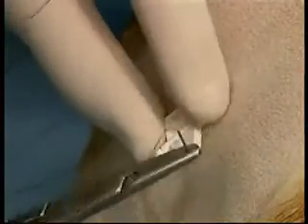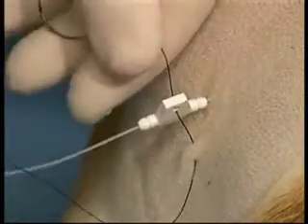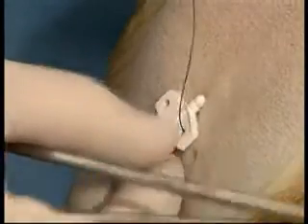A butterfly wing is placed over top of the catheter at the skin entry site and sutured to the skin. The suture grooves in the butterfly wing also must be sutured to prevent the catheter from sliding off the butterfly.